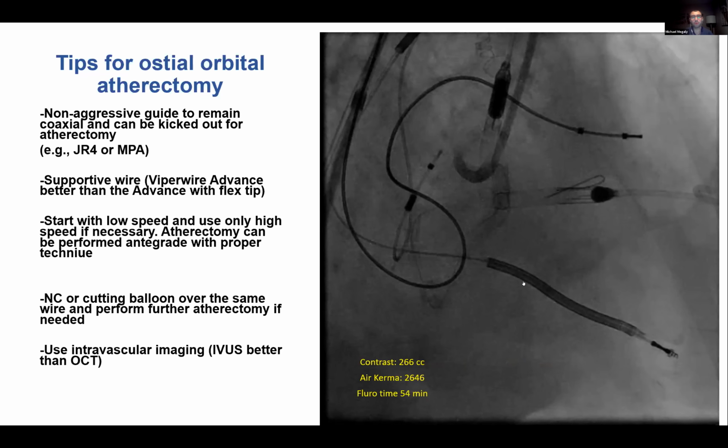Yes, and one other point: in Hereford, for all CTOs, and this can be up for debate, we don't preload them with P2Y12. We just don't. We can load them after. That's just in case a perforation happens, so you don't have an active P2Y12 on board. And we do partial reversal as well. Full reversal would be a little tough to do with the balloons and everything, right?